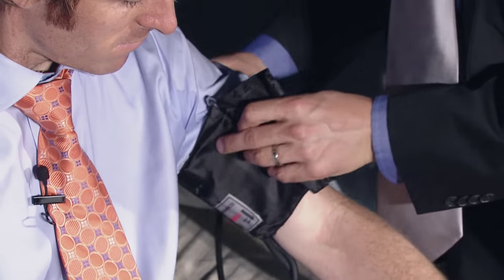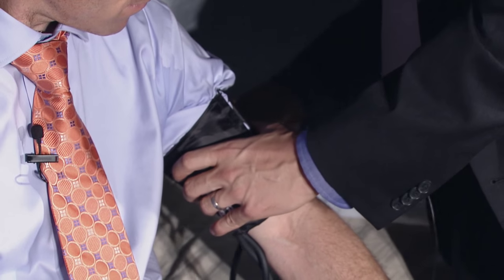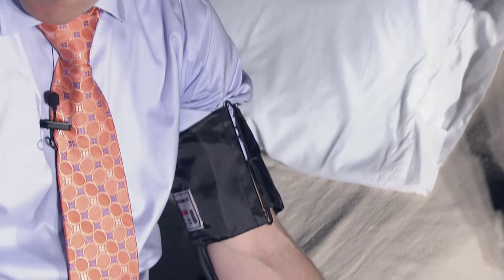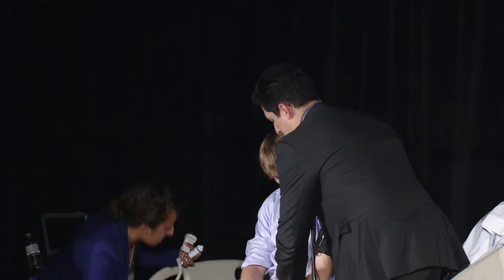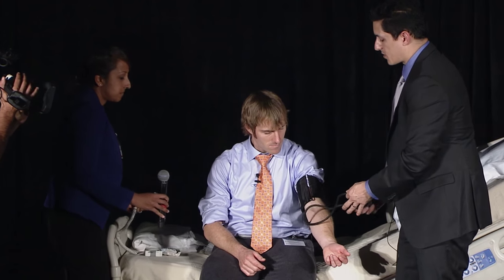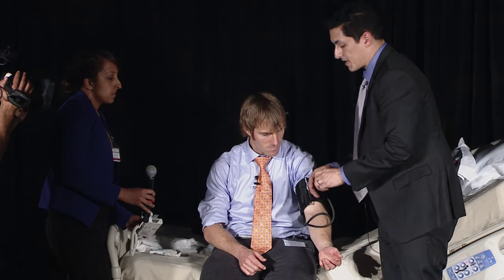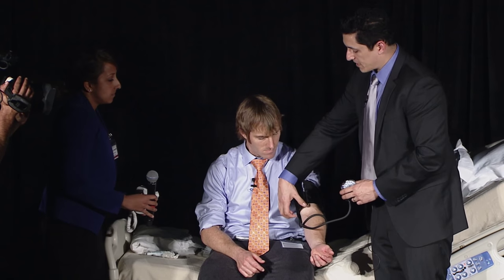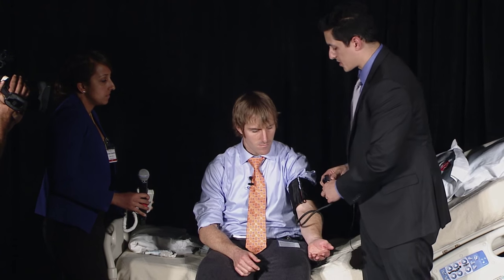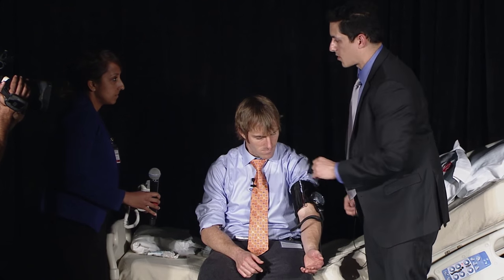When doing this with a Doppler, you want to bring the cuff up a little bit higher so there's room for the probe to go. You can do this with just one person, but in general it's better with two people, because as you inflate the cuff it gets bigger and sometimes it pushes the probe away from the artery and you lose the sound. So it's good to have someone dedicated to holding the probe.